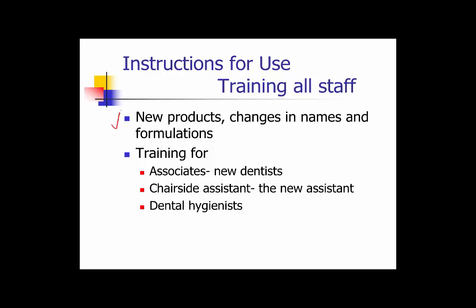And we're talking about training not just for yourself, reading the instructions when you get a new product that you've never used before, or learning how to use a new device, but also for the associates in your office, the new dentists. These new dentists may not have learned with that product. They may be generalizing about the products they're using: that all PVS impression materials are the same, all adhesives are the same, all composites are the same, the curing light they're using is exactly the same, when in fact that's not the case.